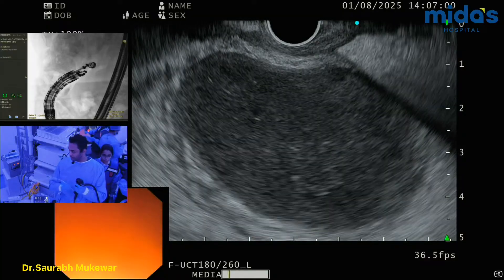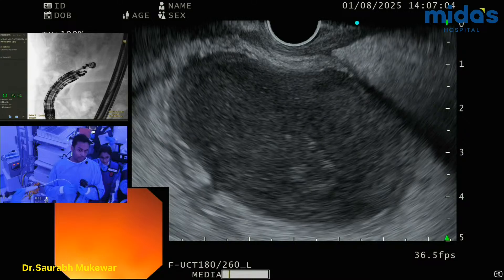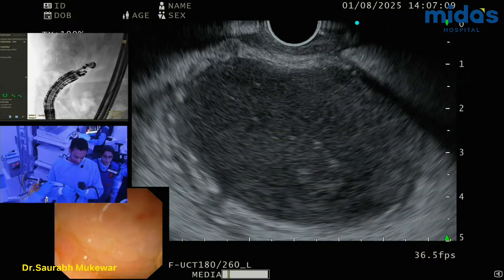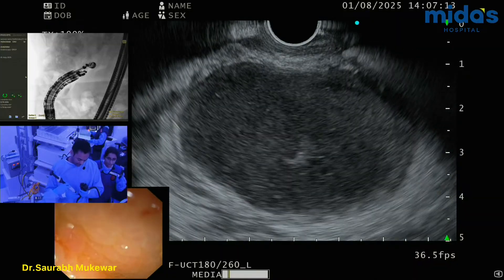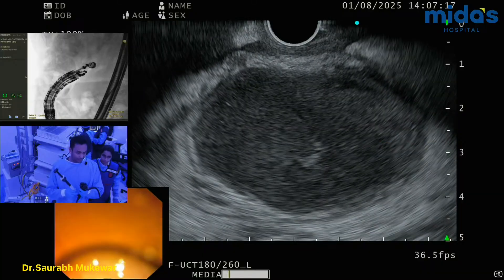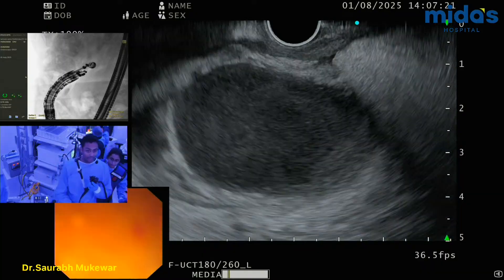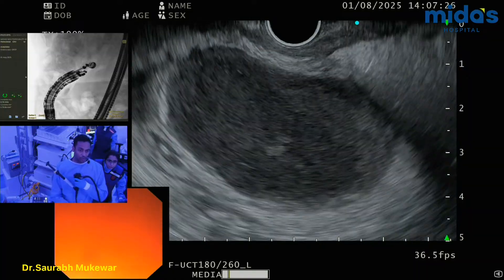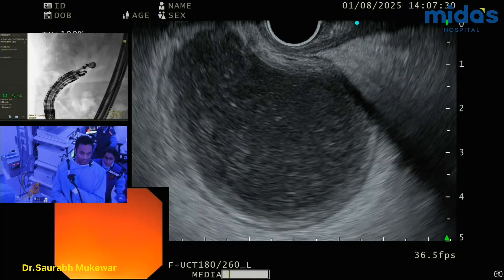Sir, do you want it to be more towards the neck and less towards the fundus? I mean, of course there would be some ideal considerations based on the plans in future. But here's the stability, the avascularity, the distance — those are your prerequisites. Once that's achieved, then based on the stone and maybe the angles for you to get in. I don't do along the lesser curvature — I would not recommend doing lesser curvature.